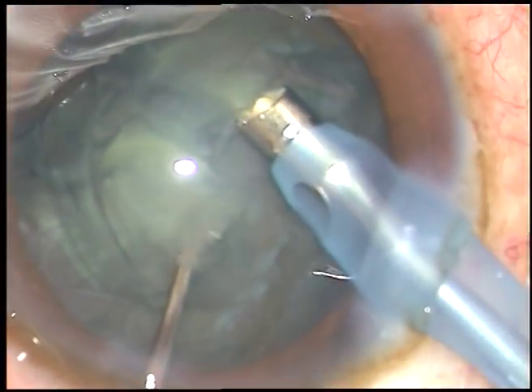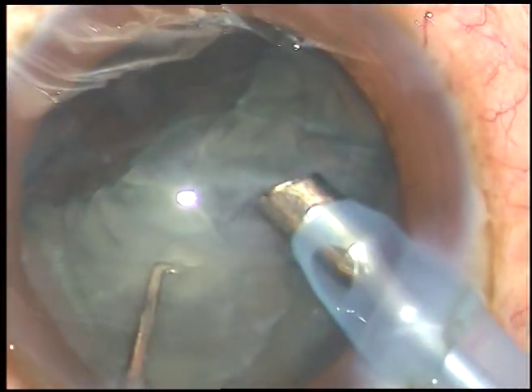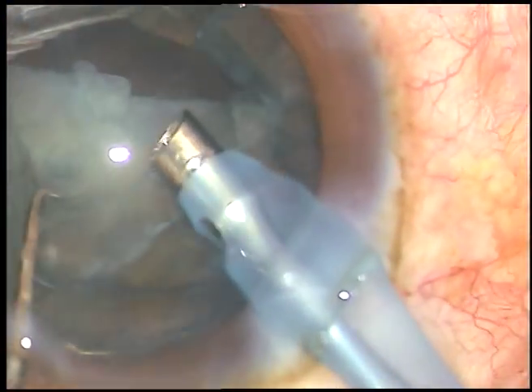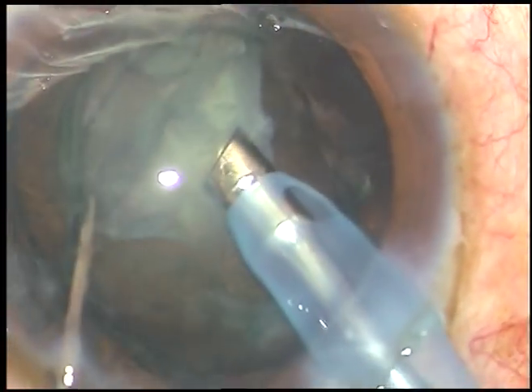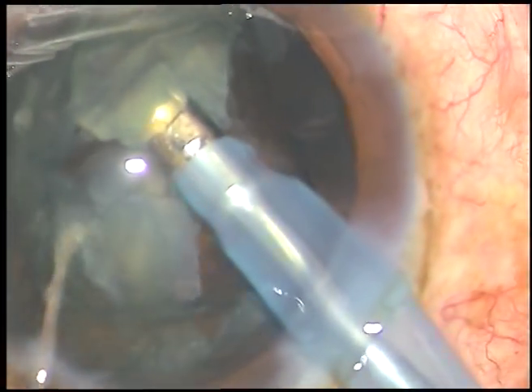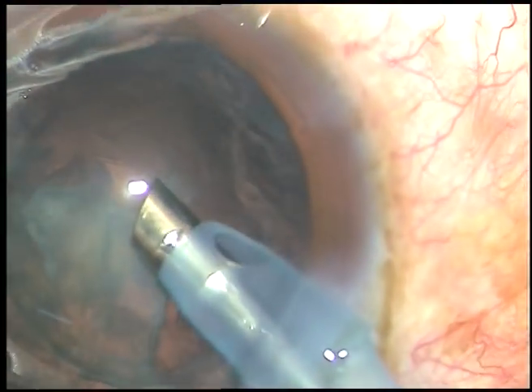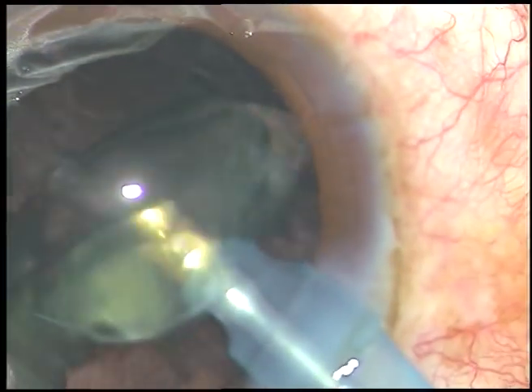I am just in irrigation mode and I have chopped the nucleus, slicing it into two halves while the phaco handpiece was in irrigation — because if I go to aspiration mode the nuclear material will come off prematurely. And the nucleus is now managed.